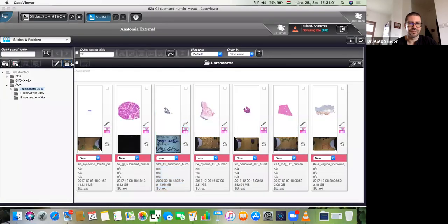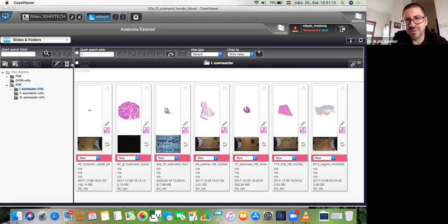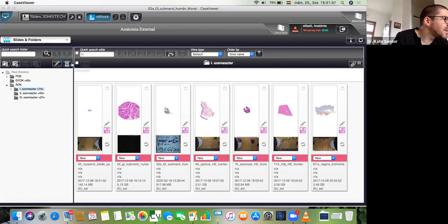Now let's see the. Dr. Katz, why is it useful to have stained carbohydrates? It's just because of the different components. So for example, we have the PAS staining, and also we have another, mucicarmine staining. They are just for the carbohydrate contents. It's eventually just a different aspect. Okay. Our next gland is the sublingual. That's the 9.